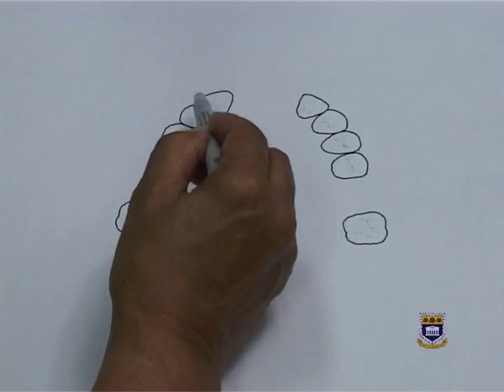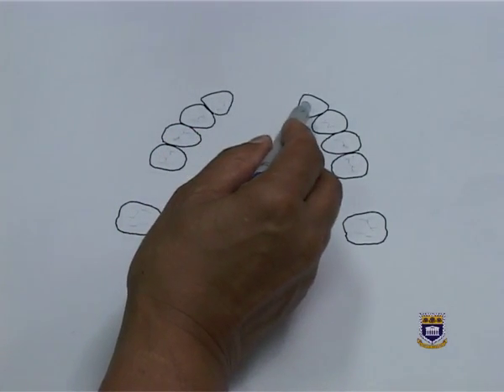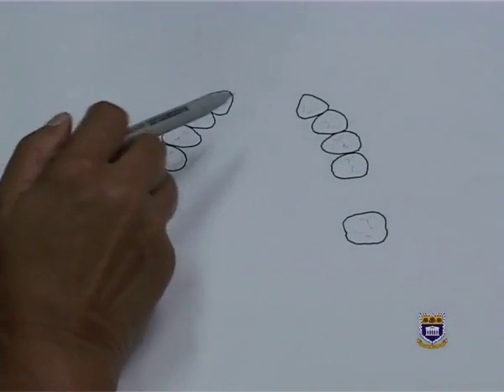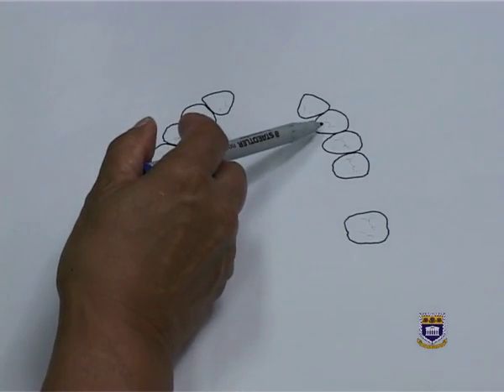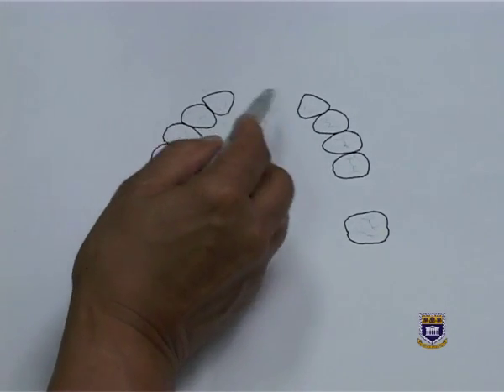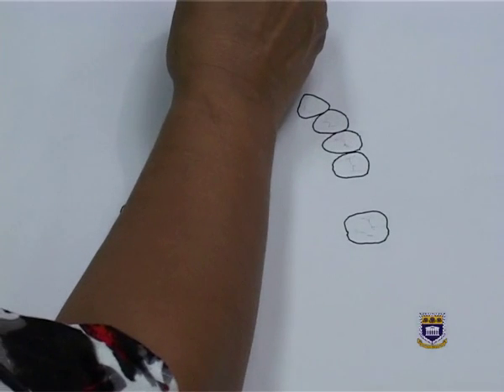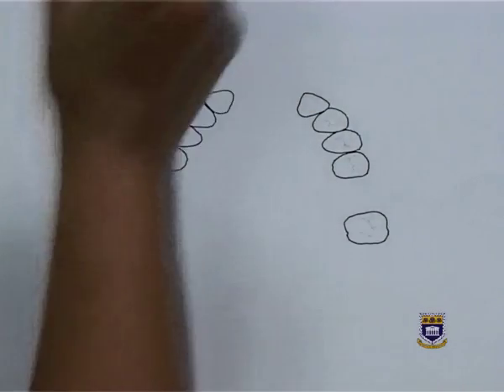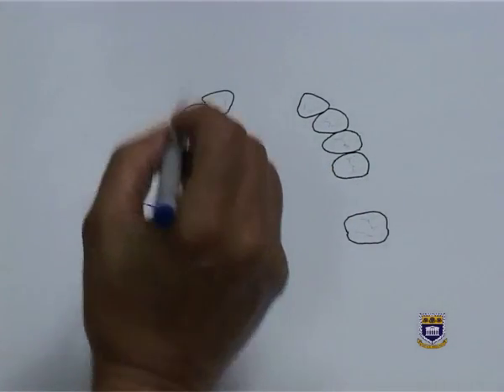The challenge with lateral incisors is that they do not in most cases provide adequate support, and in this patient, because I have canines and the canine is a nice firm sturdy root, I will use the canines to give support for the anterior saddle. So I will be designing a metal partial denture for this patient, who is also a class 3 modification 2.